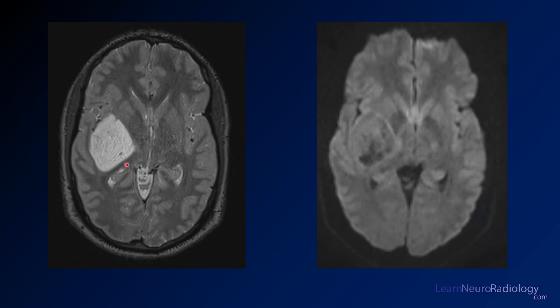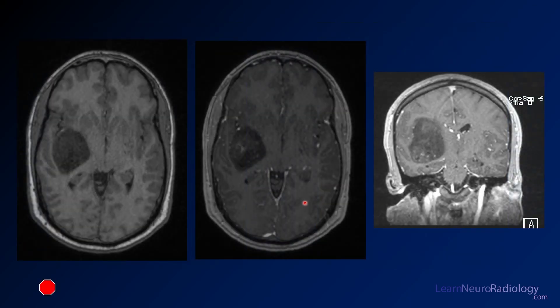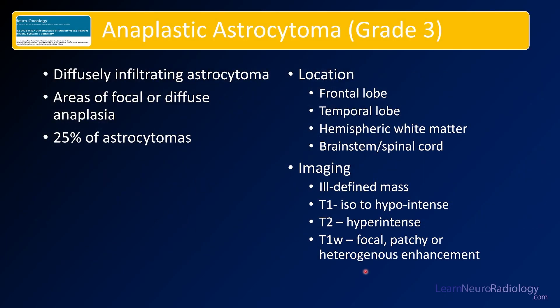Here are the MRI images. On T2, you see that mass with pretty well-defined margins. On diffusion, it's pretty iso-intense to the surrounding brain, with maybe some areas of low diffusion signal. On pre- and post-contrast, not much on the pre, but on post-contrast you see little wispy areas of enhancement centrally — maybe where those areas of hemorrhage or blood products were — and a little enhancement inferiorly. This is a grade three astrocytoma, an infiltrating astrocytoma with areas of anaplasia, about 25% of astrocytomas. Similar location to the grade twos, they can also involve the brainstem and spinal cord, with patchy areas of enhancement.